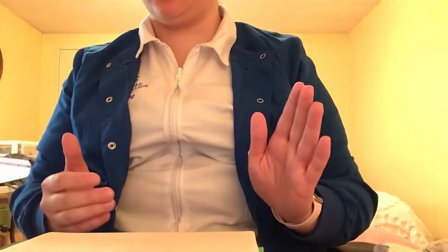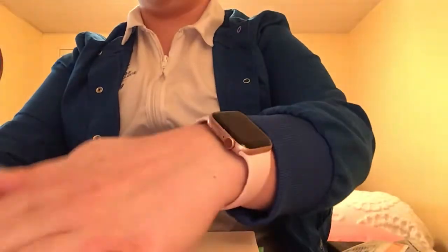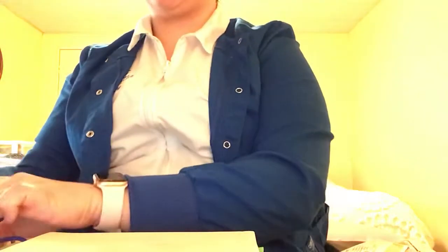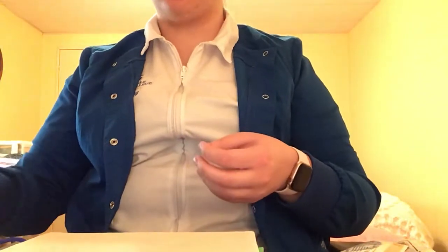So now I'm ready to go into my patient's room. So I'm going to gather both of my injections, my alcohol pads. I have some 2x2 gauze, which I'm just going to open up here, but I wouldn't open it until I get into the patient's room, just so it's out of the way. I'm going to grab my hand sanitizer, my sharps container that I'm going to put my needles in, and my gloves. So now I'm ready to knock on the door.